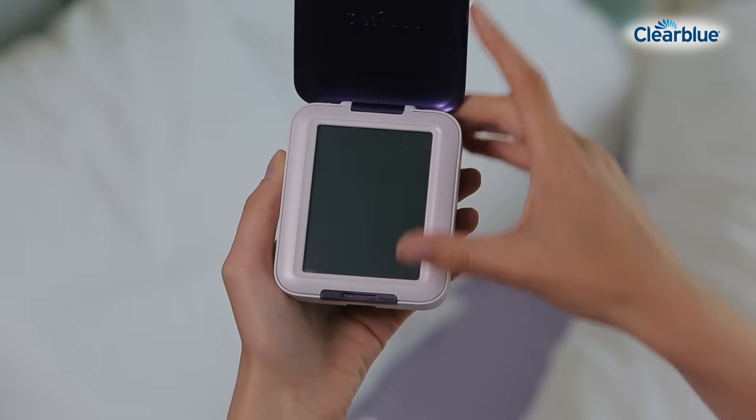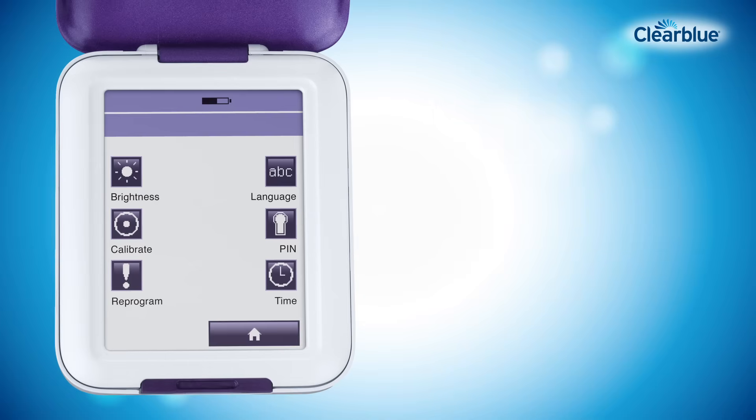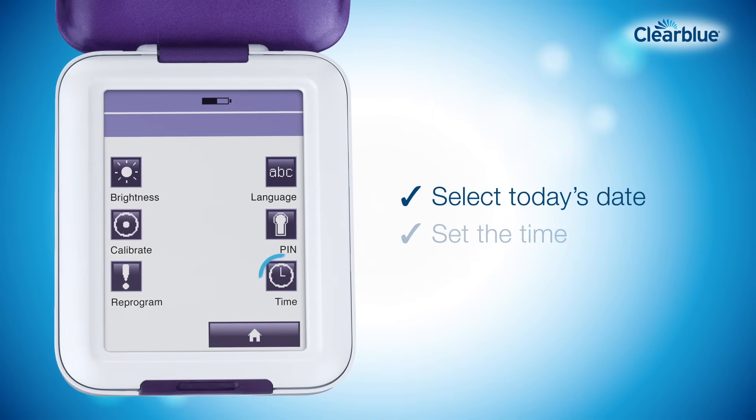When you switch on your monitor for the first time, on-screen instructions will guide you through the setup. You'll be asked to choose your language, calibrate the screen, select today's date, and set the time.